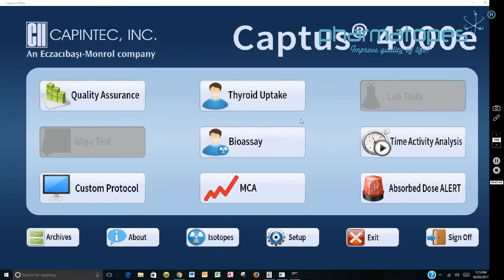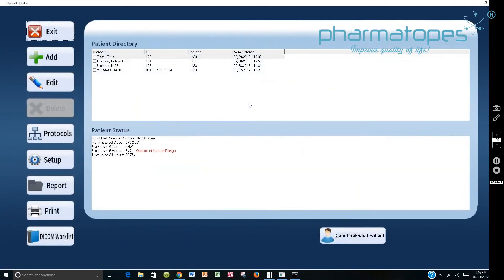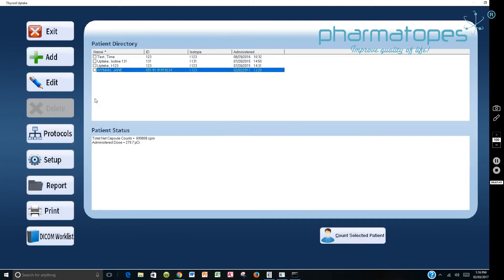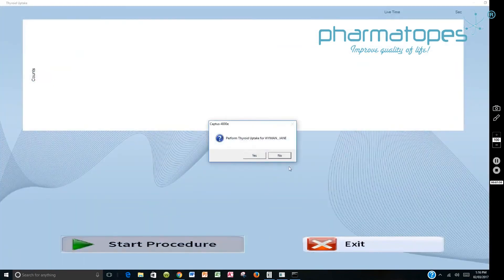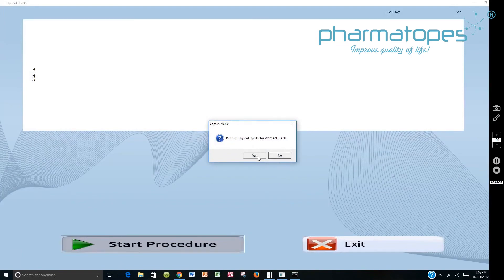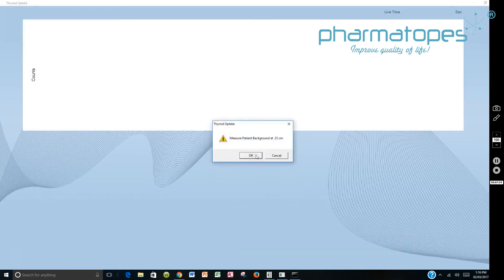So the 24 hours have elapsed. Jane Wyman's back. So we select thyroid uptake. We go ahead and select Jane Wyman. Then we're ready to count that selected patient. We'd say start procedure. It's going to ask you if this is whom you want to count. Then you'll say yes to that.